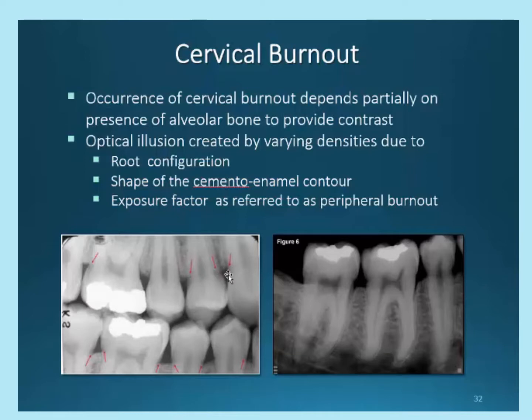Most likely this area is totally covered with interdental papilla, not visible from a visual exam. And looking in this image, you almost see the ditching out of the tooth structure. Again, note the location of the alveolar crest. Most likely this is interdental papilla covering the space. And as we know, dental decay does not occur subgingivally. It has to be in contact with air. This is not an anaerobic bacteria, but an aerobic bacteria.